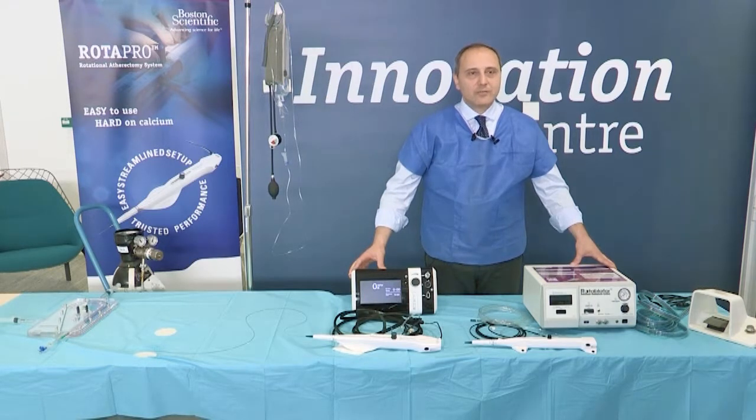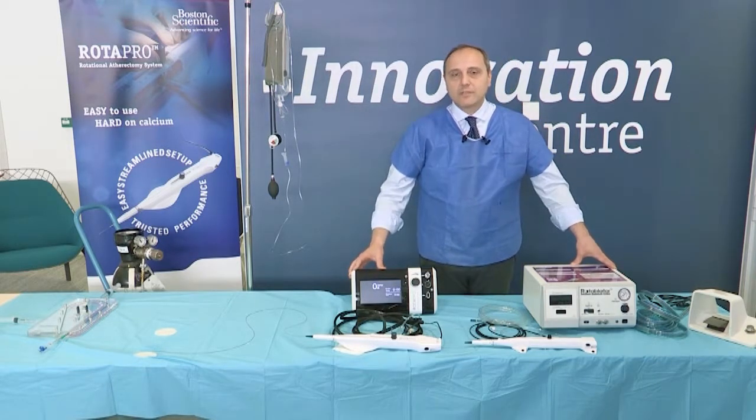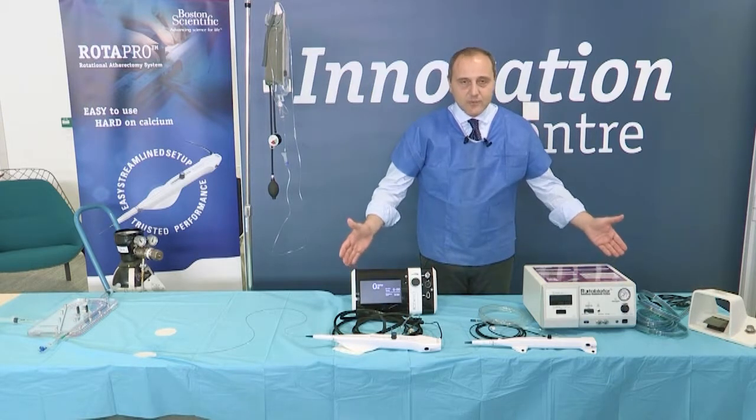I'm here today to share very exciting updates about one of the tools that is currently present in our cath labs and that will become, in my opinion, more and more important in the future. I refer to the rotablator system.